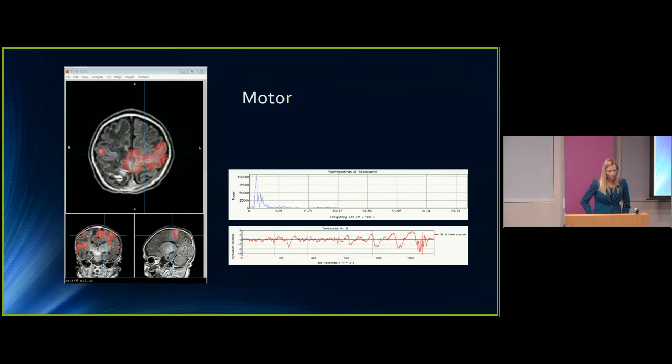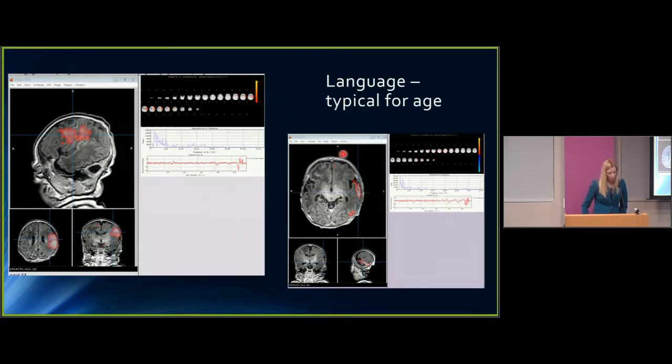We did a resting state functional MRI on this individual, and what we could see surprised me, that there was bilateral leg network activity still intact, some part of the hand network, the face on the damaged side of the brain, and the full entire motor network intact on the left hemisphere. So this individual should be able to walk and have full use of the right side of the body and a helper arm at minimum on the left arm. These were the language networks of this child, still intact and healthy looking.